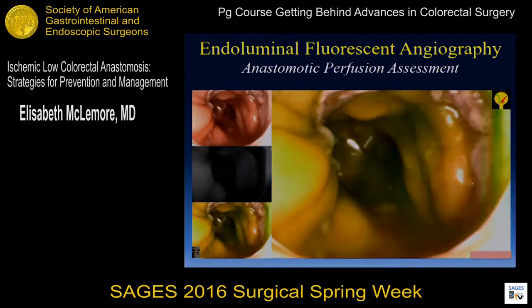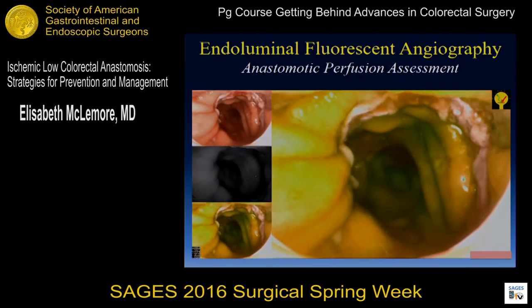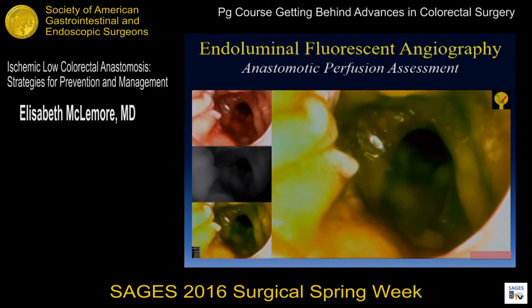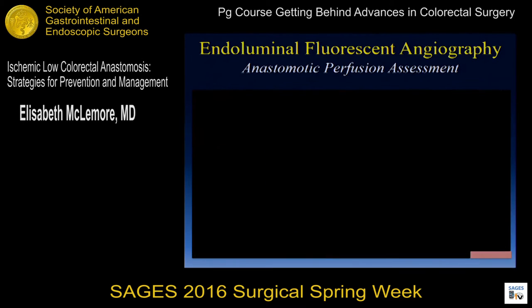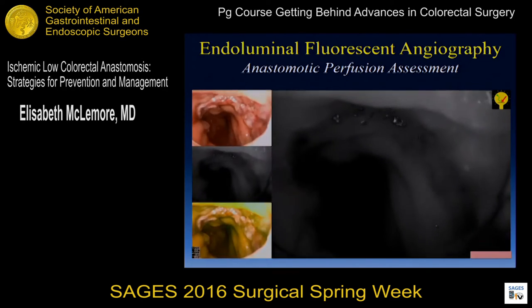So it turns out I had a great occlusive person holding my colon closed beforehand, so great that they were actually interfering with the mucosal perfusion. So as soon as we relaxed on that, phew, I got to take a deep breath in. This is just showing the near-infrared view.